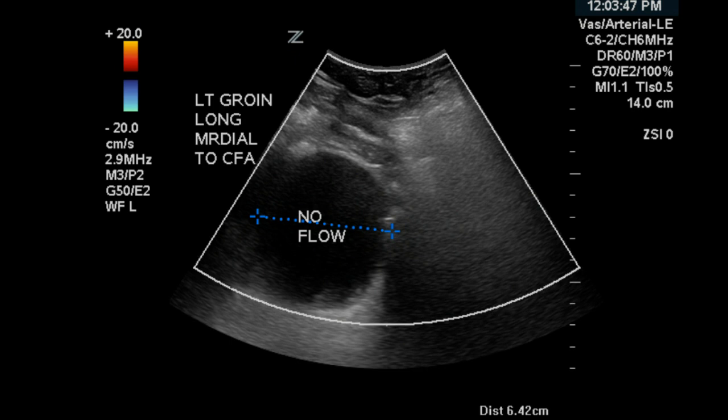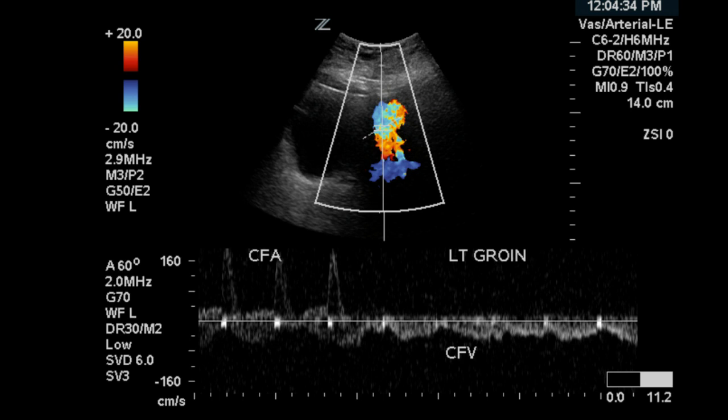The last image shows flow in the common femoral artery and common femoral vein, both of which appear to have normal arterial and venous flow characteristics. Coupled with the fact that there is no neck or flow channel between the artery and the measured structure, you can safely conclude that this is likely a hematoma.